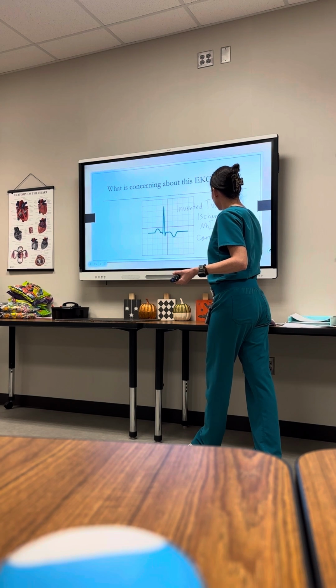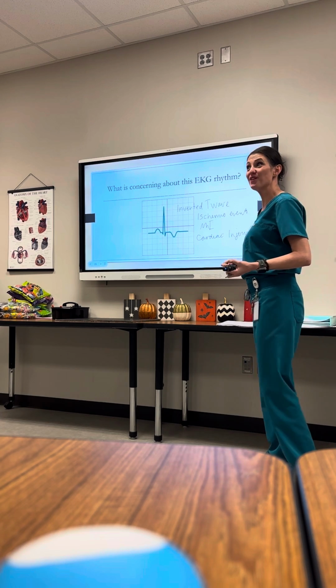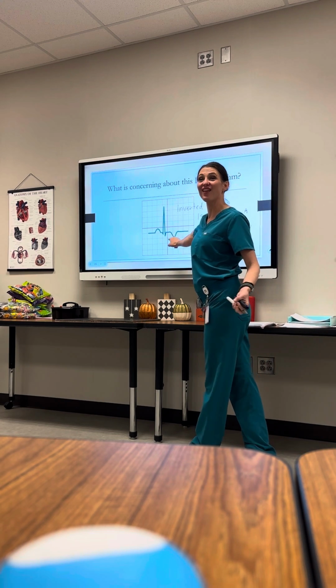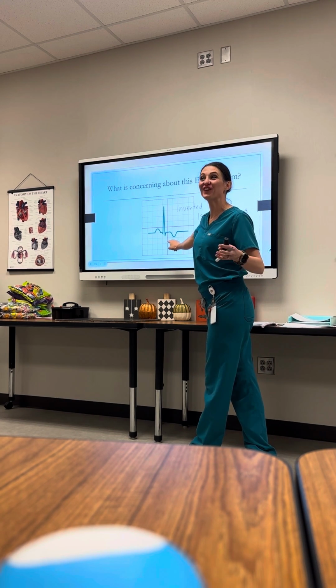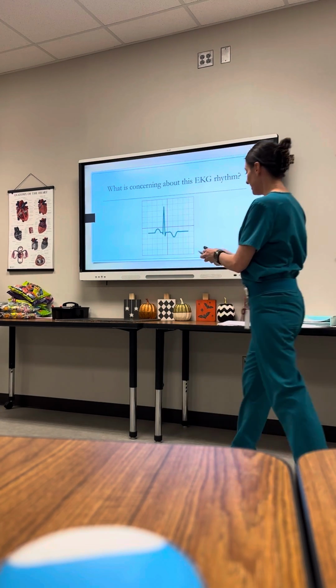Sloppy, but y'all got it. Remember? So what is this called? Say it out loud. Inverted T wave. Okay, perfection. All right, I think we got one more to look at.